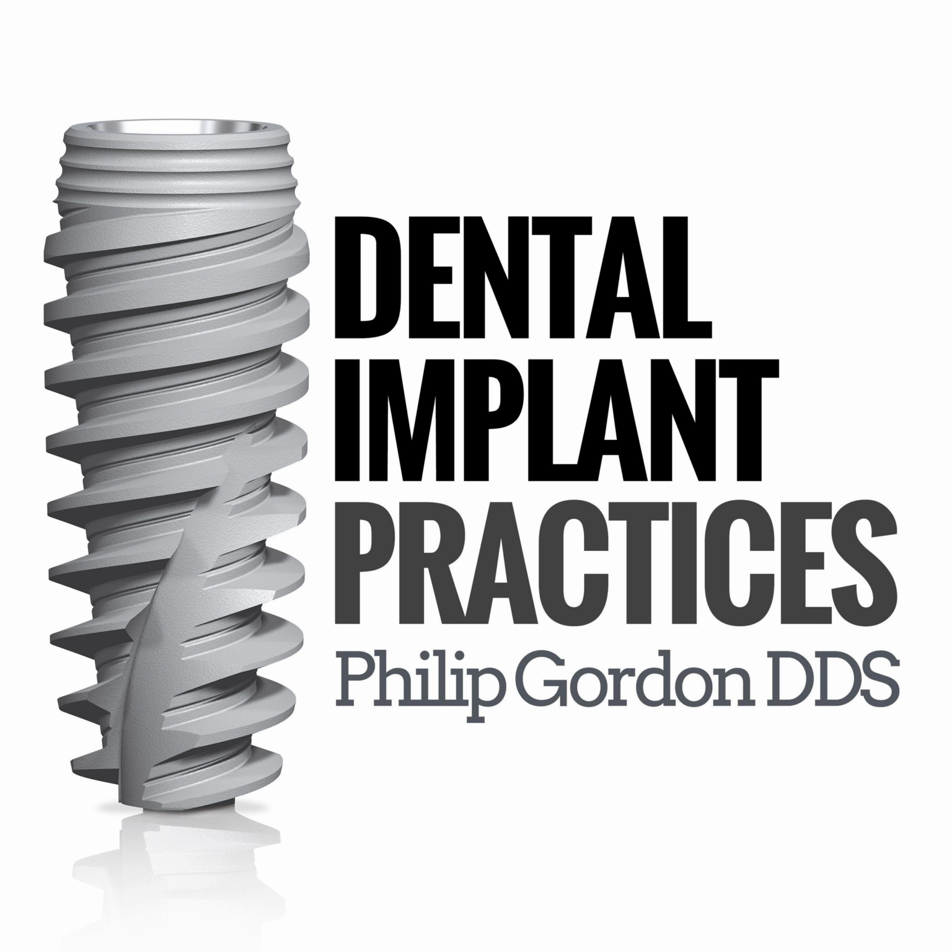So we need those photos to make sure that the bite in the scan matches the bite in the photos, which matches the bite on the models, because when someone's terminally dentate, they could have a different bite at different times, depending on if they're in pain or if the teeth are mobile. So we want as much information as possible, because we want that prosthetic bridge to go in there beautifully, midline, and the patient likes the shape of the teeth, all that. So the more information, the better.